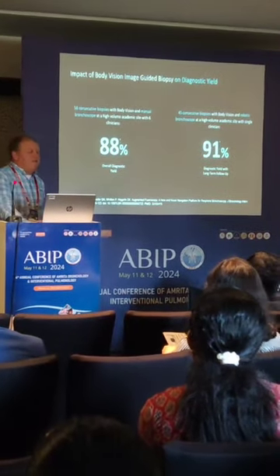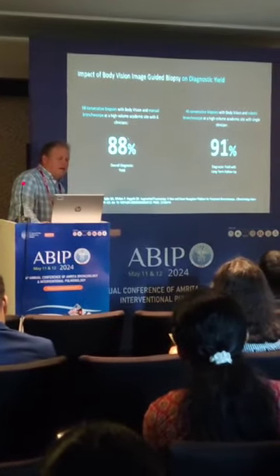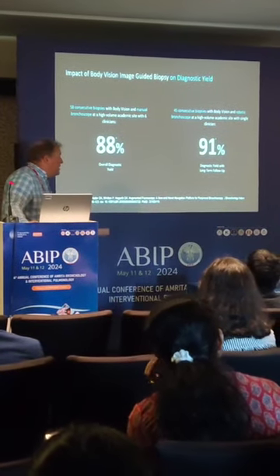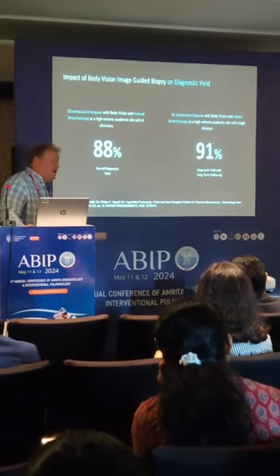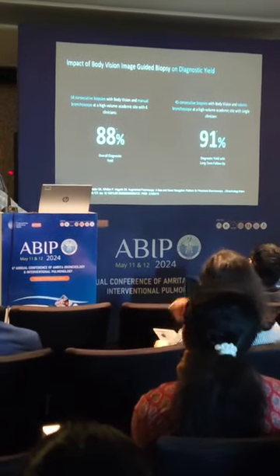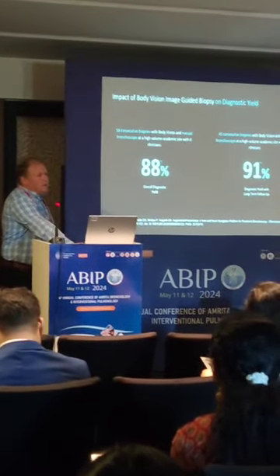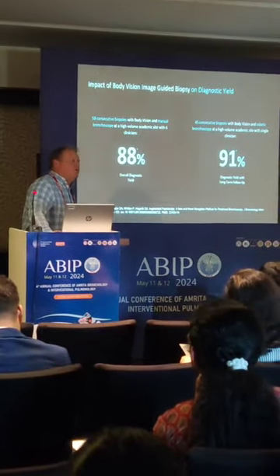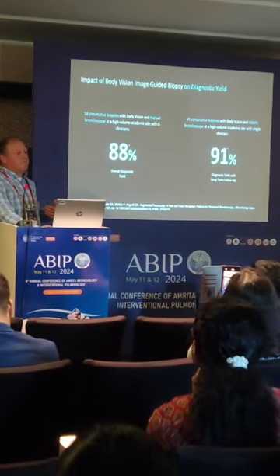When you take a look back then at the follow-up paper from the Sasania group, I was in that paper too. Overall diagnostic yield was 88%. And then we combined this with our first generation robot, and we got 91%. That's not been published yet. It's just been presented. The 88's been published. Now again, still not, I think, as high as we'd all like it. But if you actually look at the IR literature, their yields are 90%. They're not 100% either. So now we're trying to reach, I think, finally that pinnacle that we've all tried to achieve, which is I want yields like IR, but I want complications like a bronchoscopy, right?